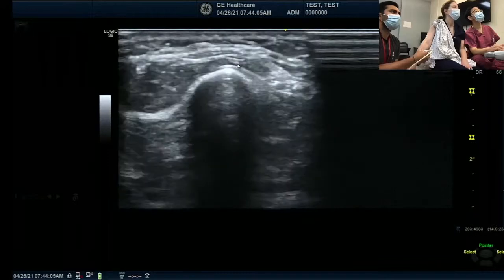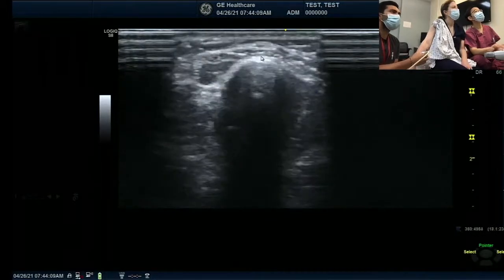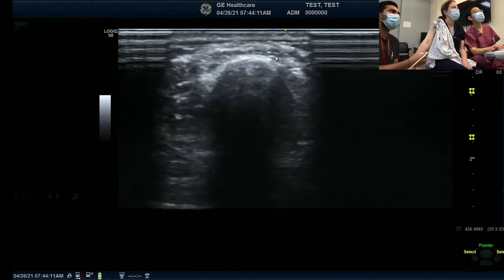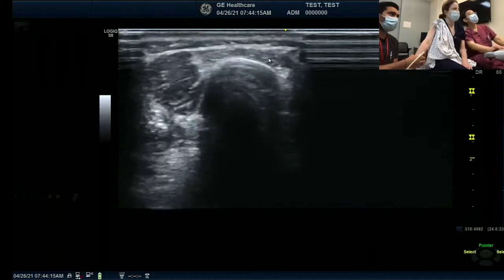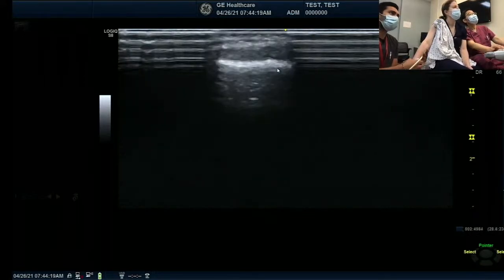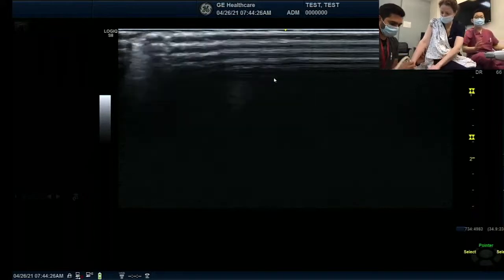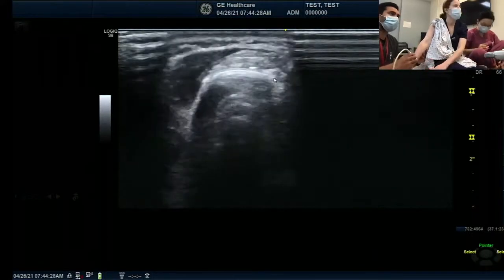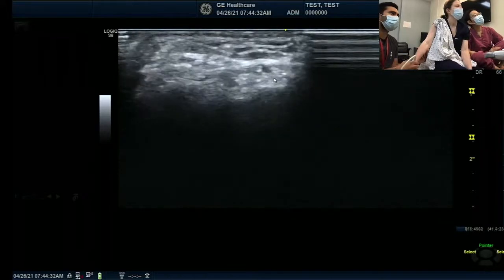Go downstairs continuously, distally. See? Continuously moving. To go to your first snuff box, in between the first and second. Yeah, it's hard there. But I think the radial nerve is the most difficult one.